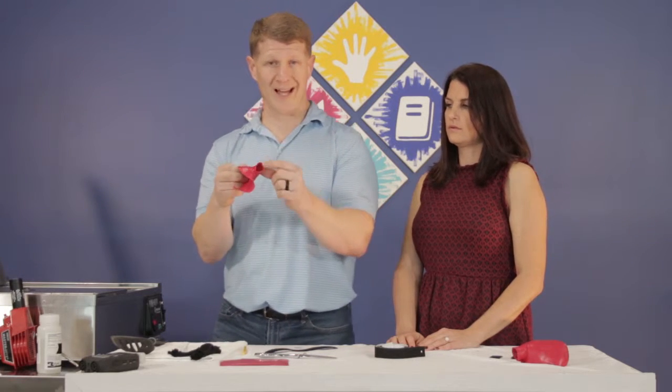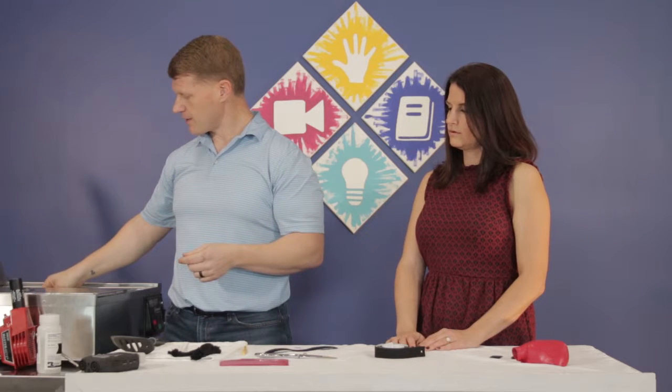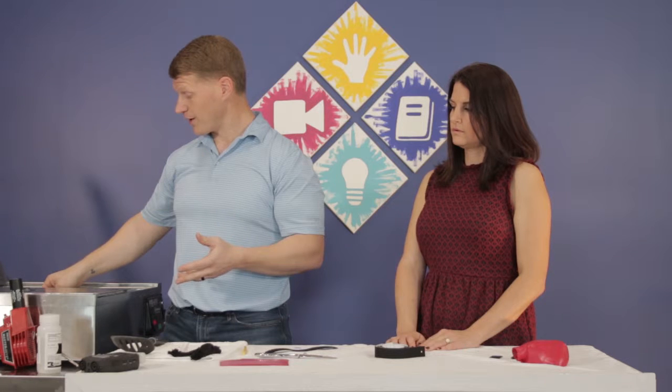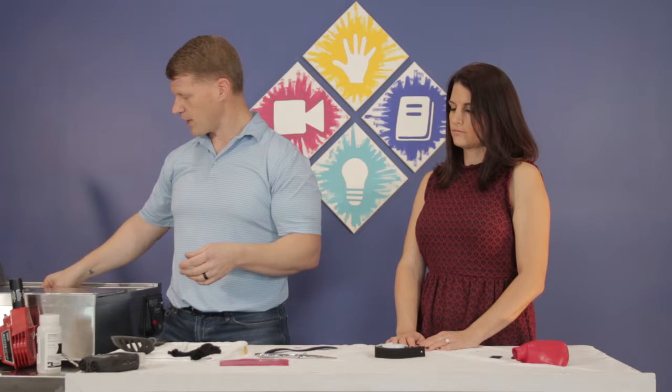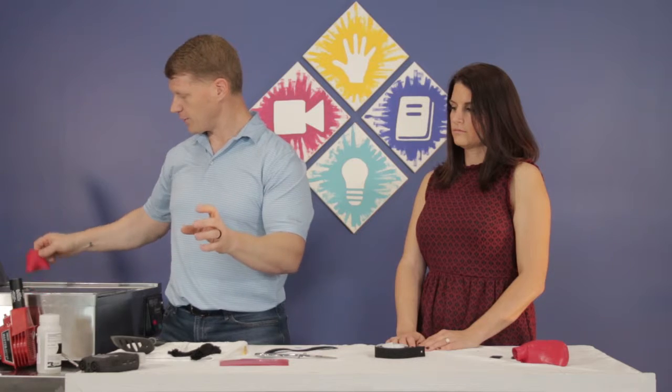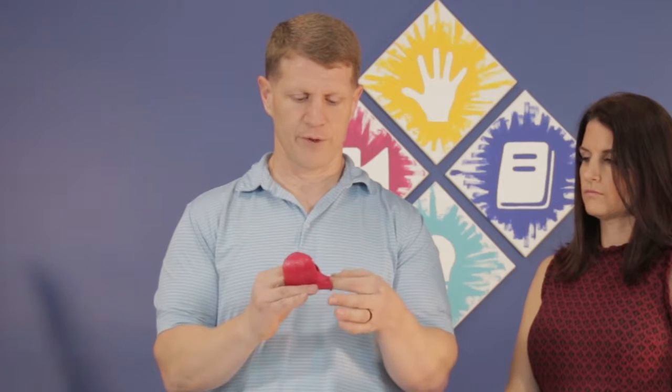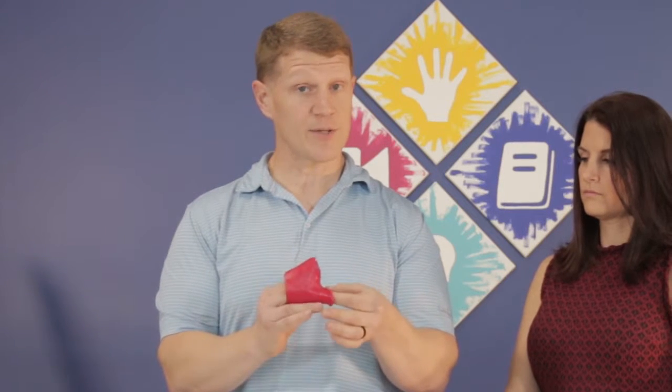Now that we've made it on Miranda, we need to finish it. The first thing I'm going to do is roll that top edge — it's a little bit sharp. I'm going to dip the very tip of that thumb end in the water for about five to eight seconds, not very long. I can watch it start to contract a little as that material shrinks. Then I'll just roll it out — that gives the patient a little more comfort around that edge and takes it down just a little if you've got it too high.